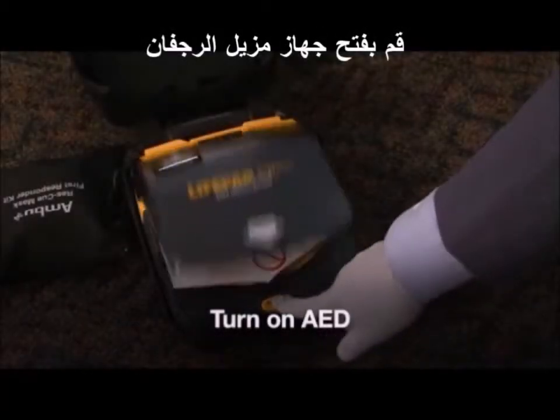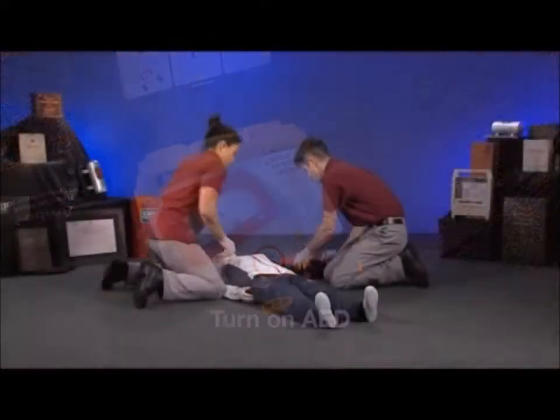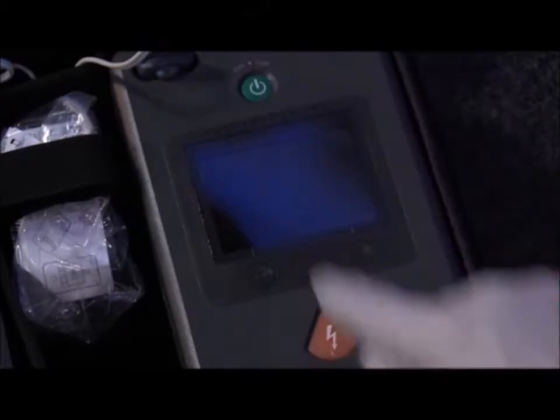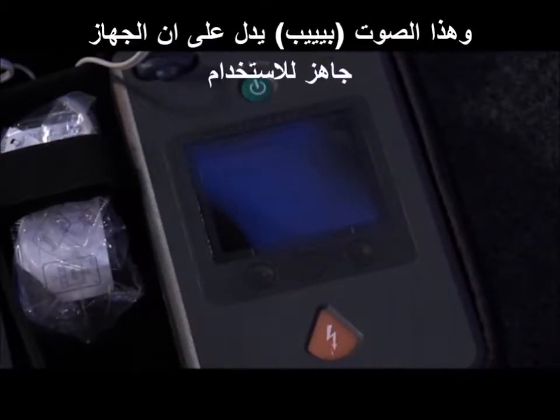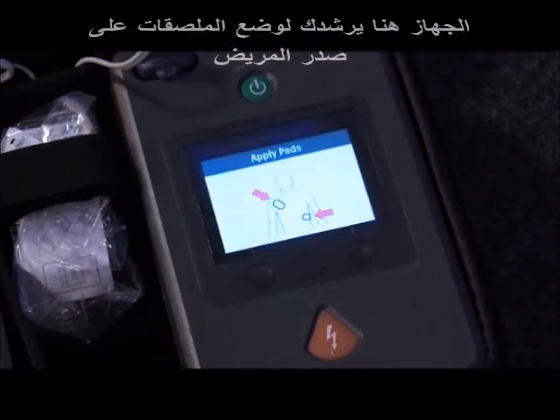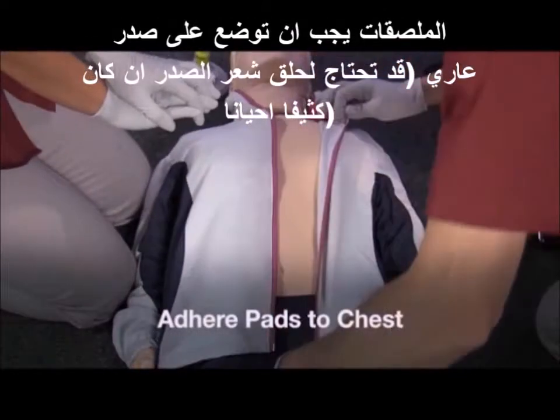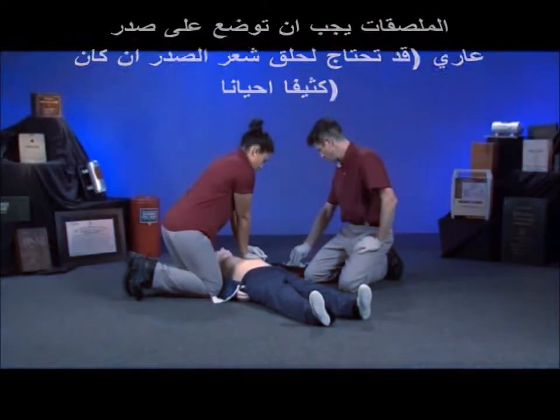Opening the lid will turn on the power for some AEDs. With others, simply press the power button. This starts voice instructions and readies the device for use. Apply pads to patient's bare chest. Pads must be applied to a bare chest.